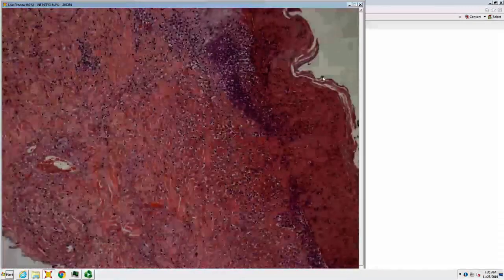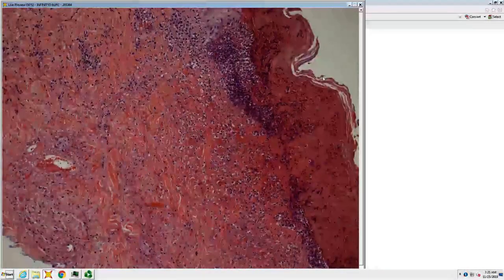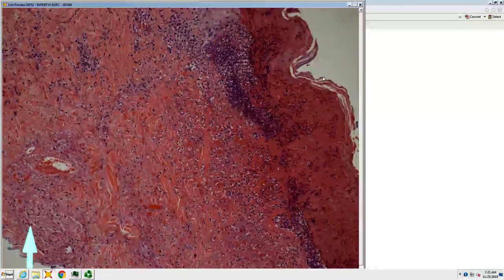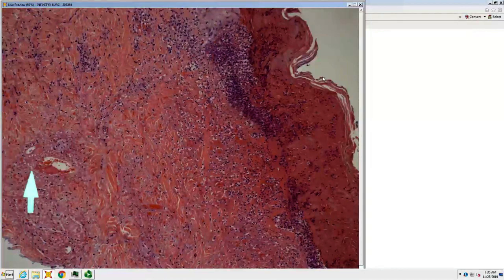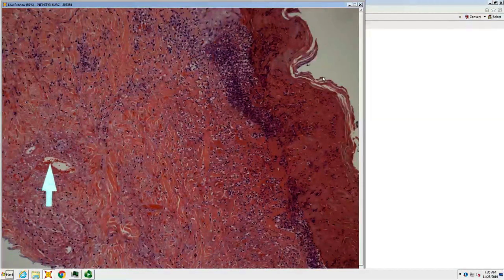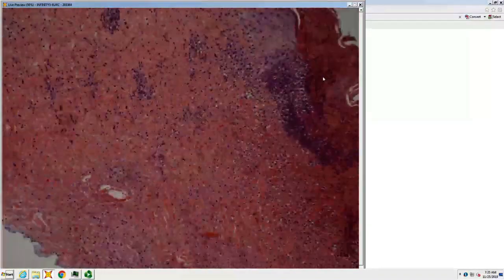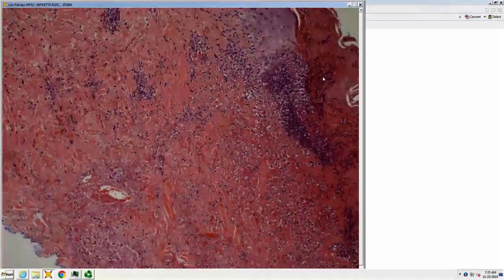Inflammation, necrosis, and that's an erector pili, which implies that's the follicle. It's all necrotic. You are correct, that's zoster. So eosinophilic necrosis of the follicular unit, whether sebaceous gland or follicle, think zoster. And that way you won't miss it.